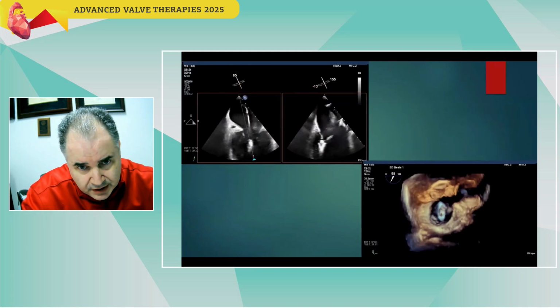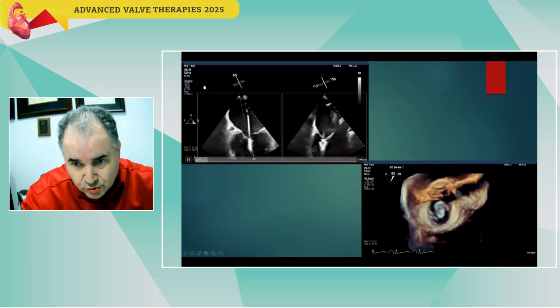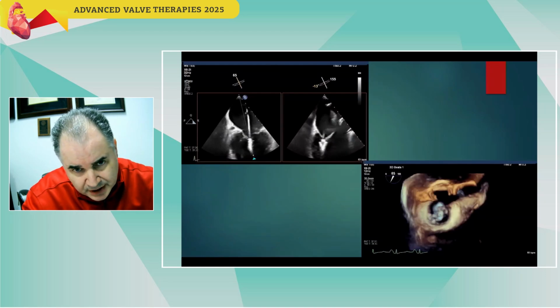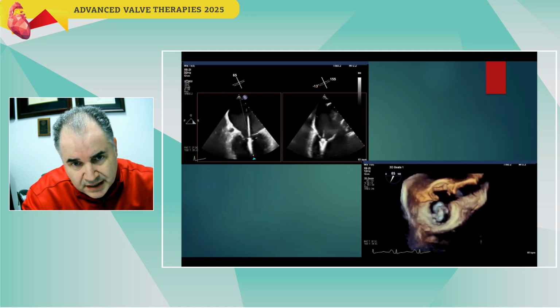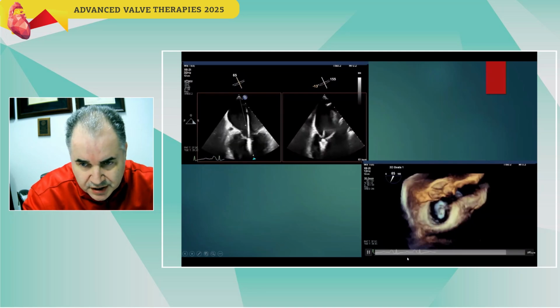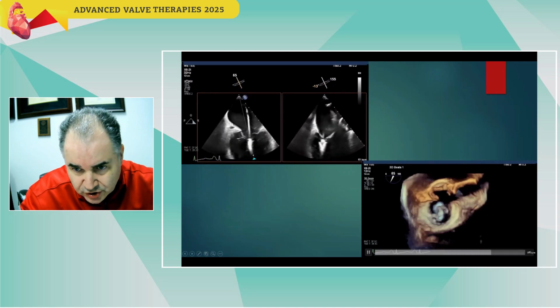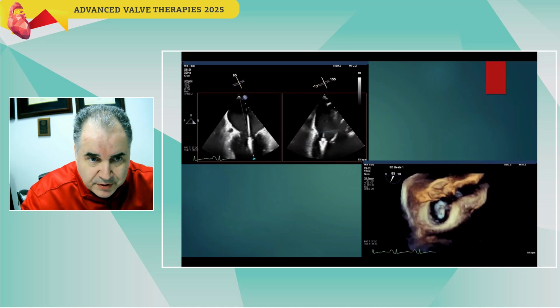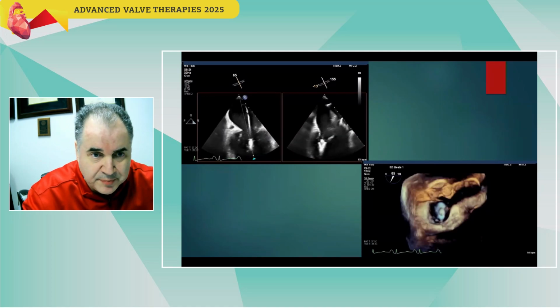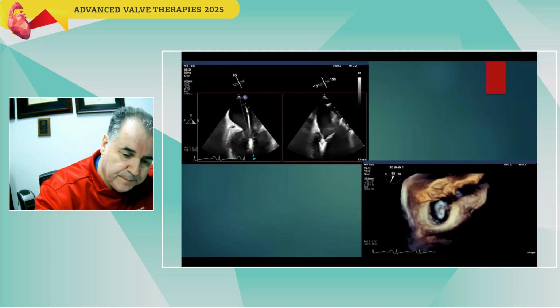Now the clip is into the ventricle, and again the same thing, because sometimes if you have a lot of cords, the clip can change position by going from the atrial level to the mitral level to the ventricular position. So we always check again with 3D imaging to make sure that it maintains its position. And here you have to decrease the 3D gain in order to see the clip in the ventricle and to make sure that the position remains perpendicular. Otherwise, you have to clock or counter-clock, depending on the position, to bring it again perpendicular to the mitral apparatus.